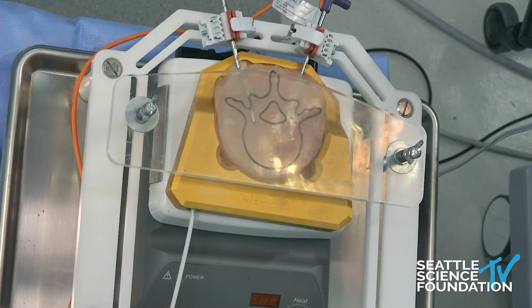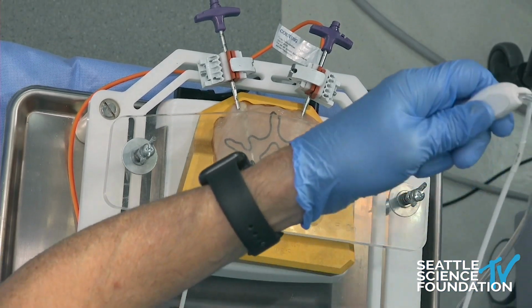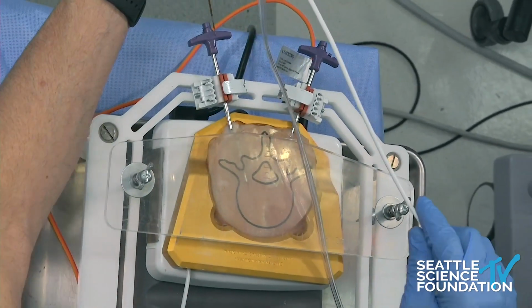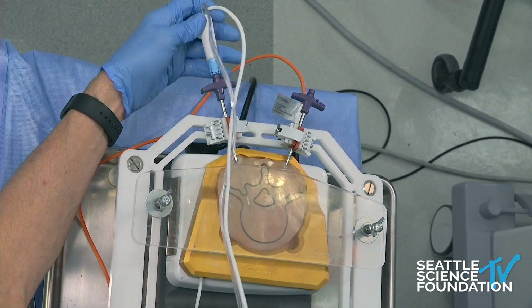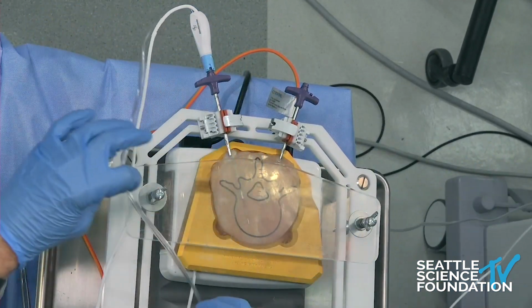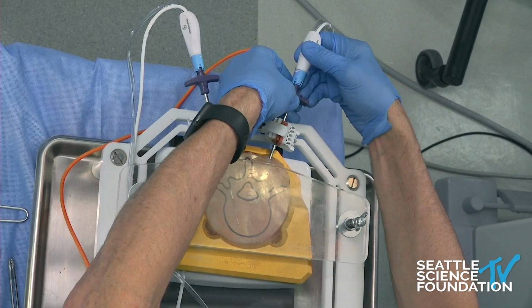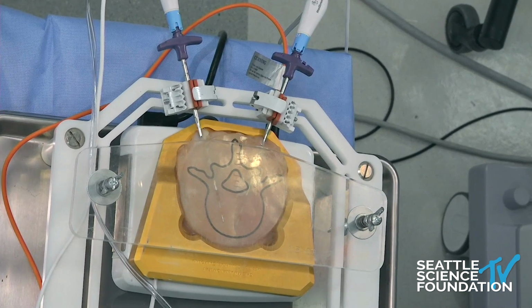And this is the OsteoCool. These are the OsteoCool probes. We'll do a bilateral access. Pull this a little bit this way so we can see. The probe will fit, and it has a press fit on either side. You can see the probe will go all the way to the anterior portion of the vertebral body. Press fit on the other side. Same thing, you can see the probes, and then we'll go ahead and turn this on.